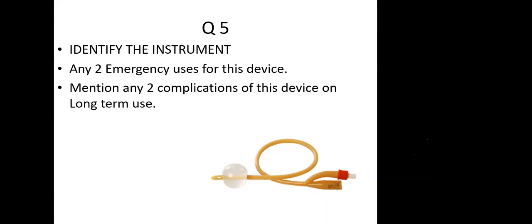Okay. Anything to do with an emergency appendix in an intestinal obstruction? This has been an old on-table favorite. Lavage. This is an on-table colonic lavage. Very good. Okay. Anything to do with the rectum and this device?